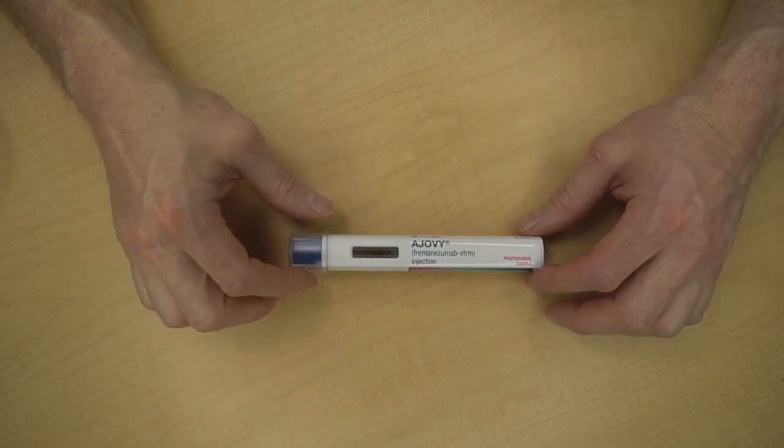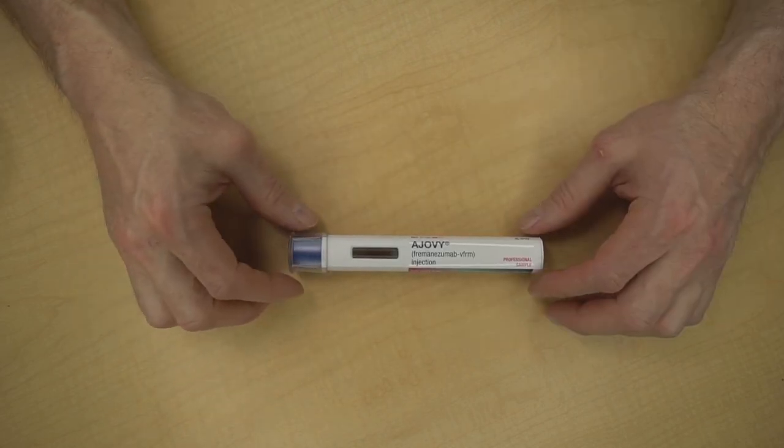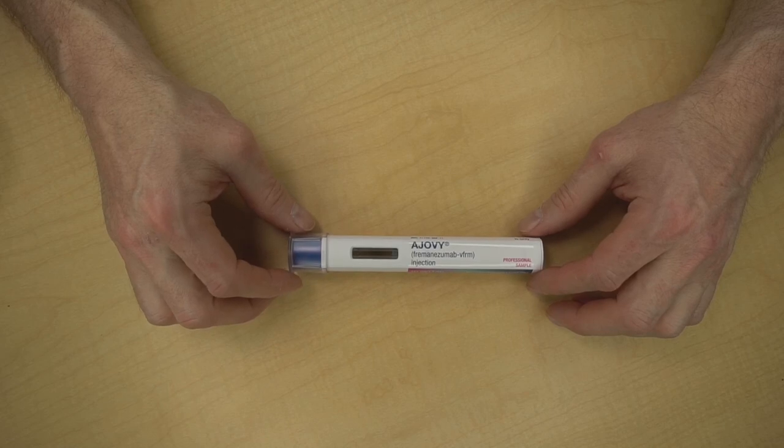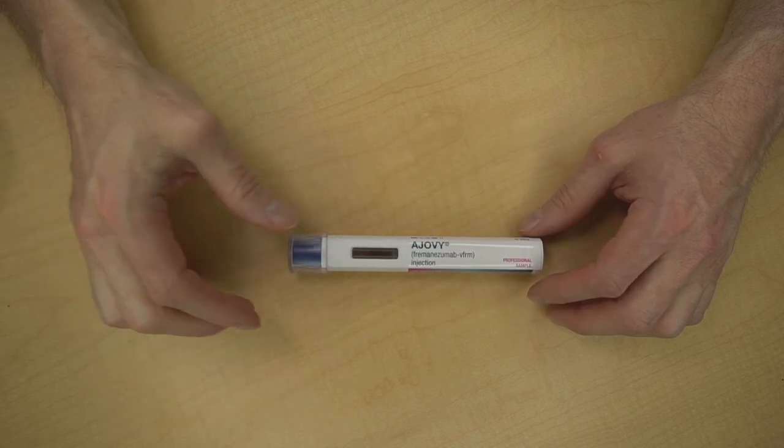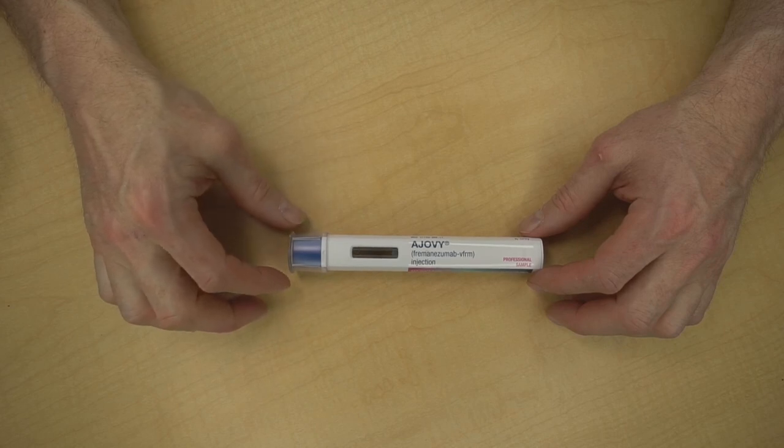The second step is to choose your injection site. For Ajovi, the injection sites are the tummy at least a couple of inches away from the belly button, the front of either thigh away from your knee or groin, or if you have a helper, you can choose the back of your upper arm. To do the quarterly dose of three injections, you can use the same body area, but don't do the injections in exactly the same spot.